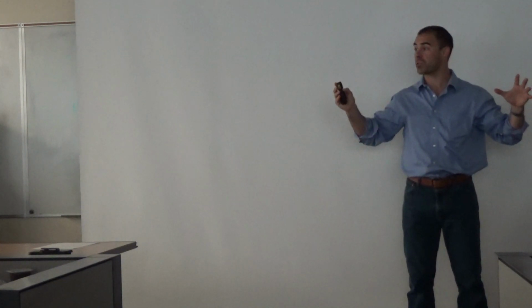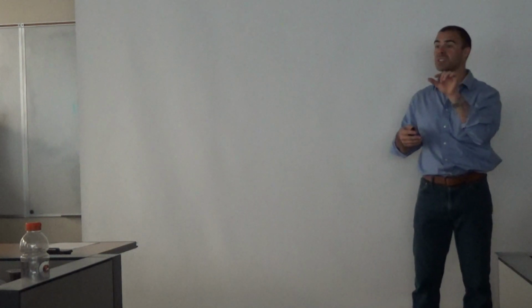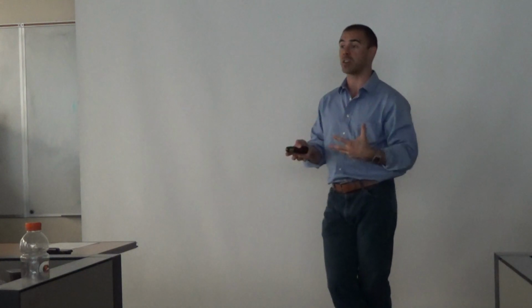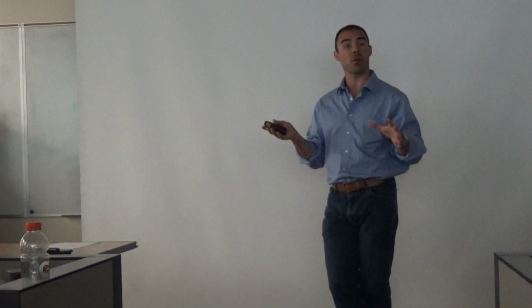So remember we talked about earlier today that because we know that there's a decay function across the scalp at a certain rate, you take that knowledge and you apply it to subtracting that value of the blink out from the rest of the head's electrode sites. And it's going to be a little bit smaller subtraction the further and further away the electrodes are from the eyeballs. Make sense? That's the simple version of what we'll talk about with ICA. And we're going to save ICA's more in-depth lecture for a little bit later in the course. We'll kind of build to that point. But for now, does that give a pretty good review of what we talked about?